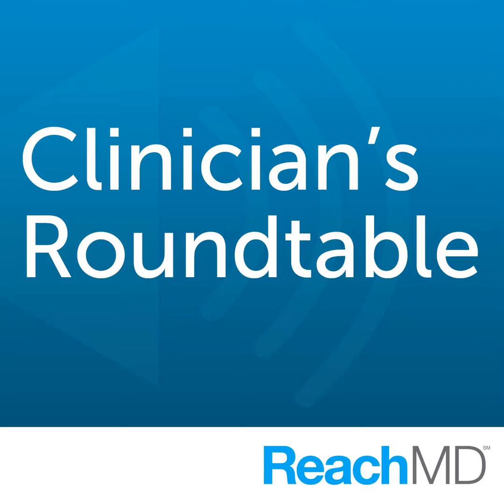Dr. Cates, when you do a mission rehearsal with virtual reality prior to a carotid stenting procedure, has this actually changed how you would approach things in the actual patient? It certainly has. In fact, on the first patient that we did mission rehearsal on, that is loading their information onto the simulator and practicing before we do it live, we found that a certain catheter allowed the guide wire to go up into the wrong place, that we did not want the wire in the left subclavian.